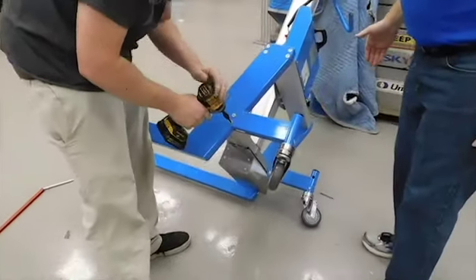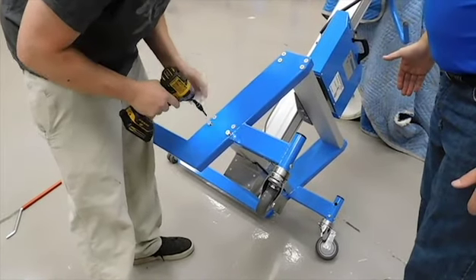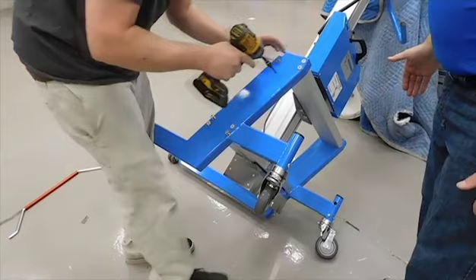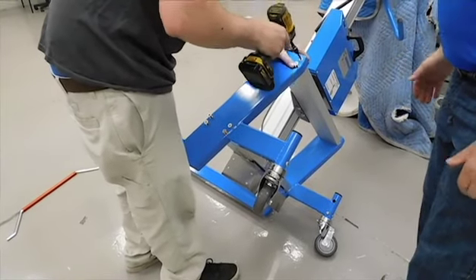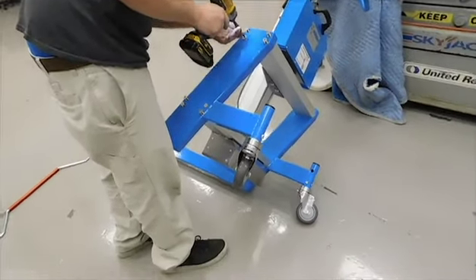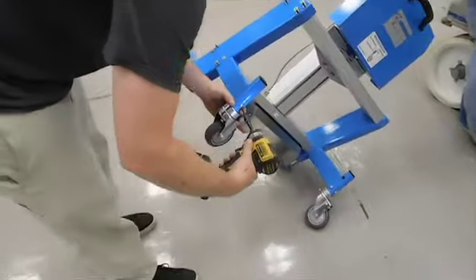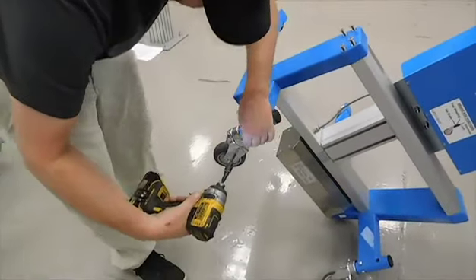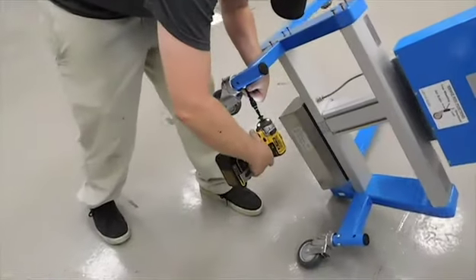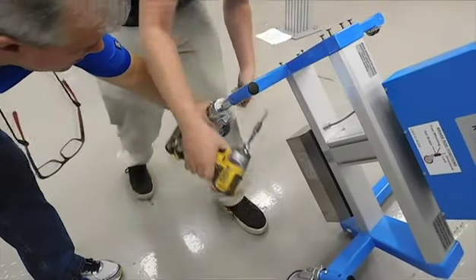Now in this case, all you really have to do is loosen these like that. Then you can take this caster out.